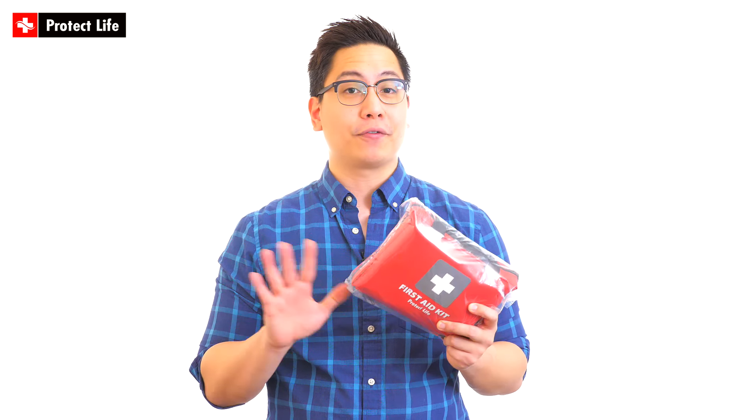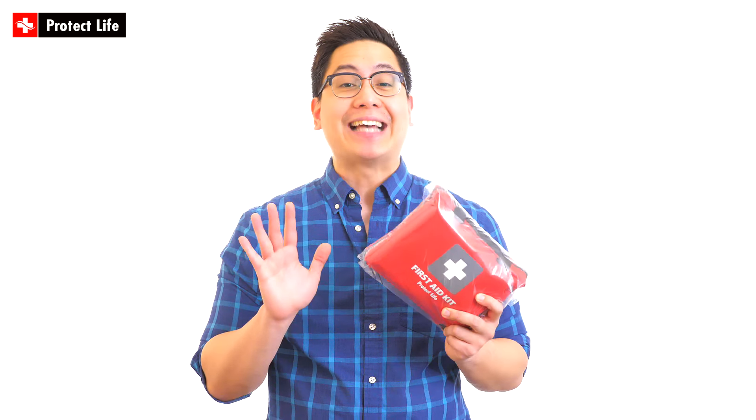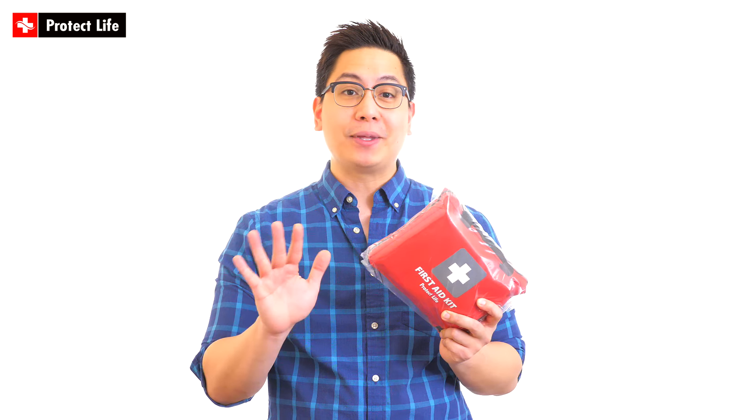Hey guys, we're here to talk about one of Protect Life First Aid Kits. This 200-piece version is perfect for home, camping, workplace, survival, or wherever you want to go — keeping it in your car or in your backpack. It is highly recommended, so certainly something to look out for.